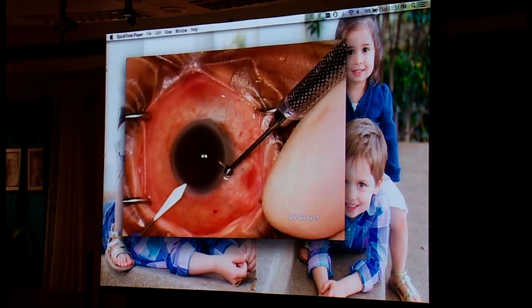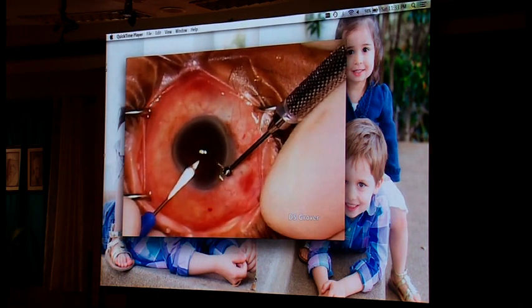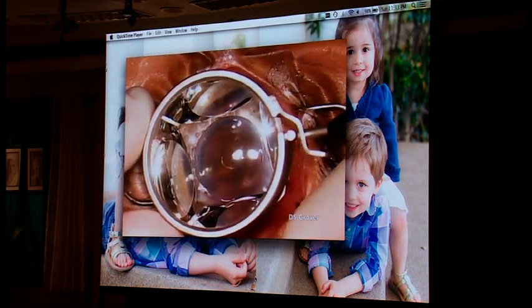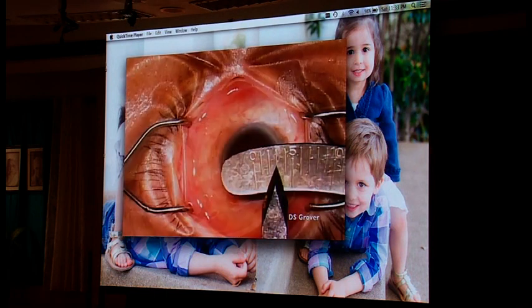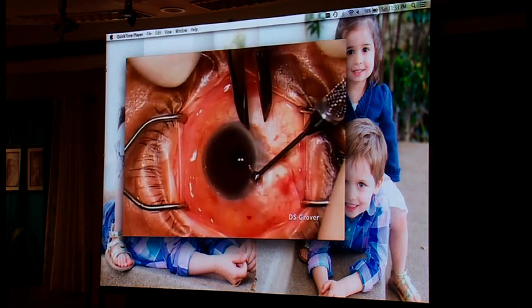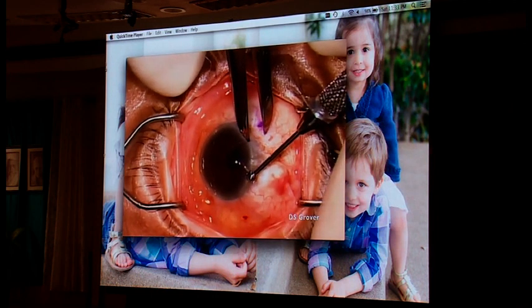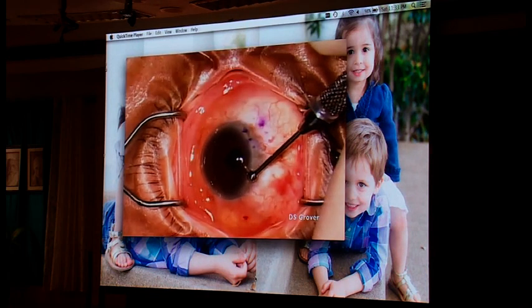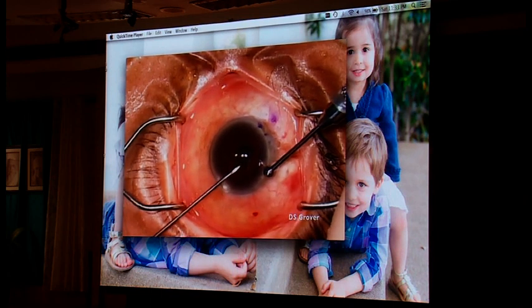It makes it a little challenging to find because we're not used to finding it when it's that anterior. And that hook allows you to see it a little better. I always look on gonioscopy at the target quadrant, and then the company says 3 millimeters. I actually did 2 millimeters, so I'm going to cheat a little bit and cause my anterior limbus marker to be a little more anterior. But I'd say 2 millimeters is where you should measure. I do about 3 marks. That's where I know I want to come out, right at the posterior ink mark. And then a little shimmy goes through that corneal wound, so you know where you're going.